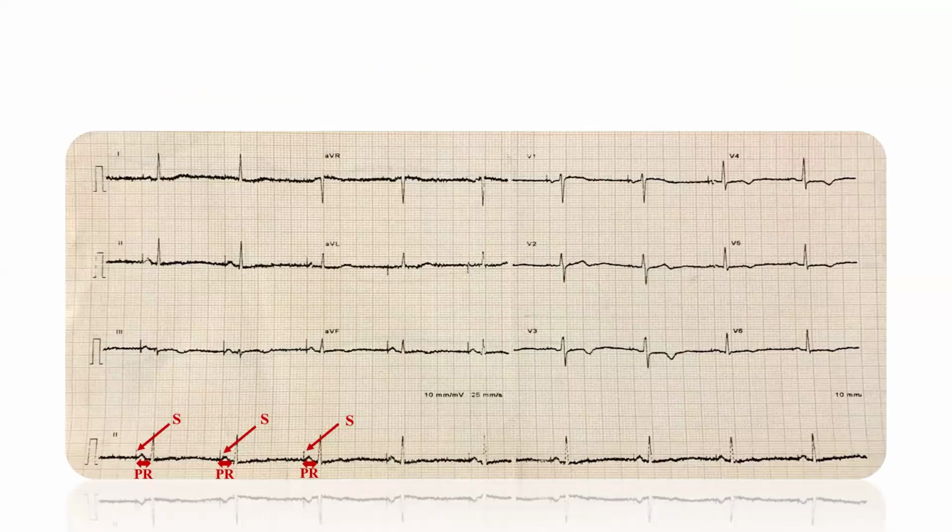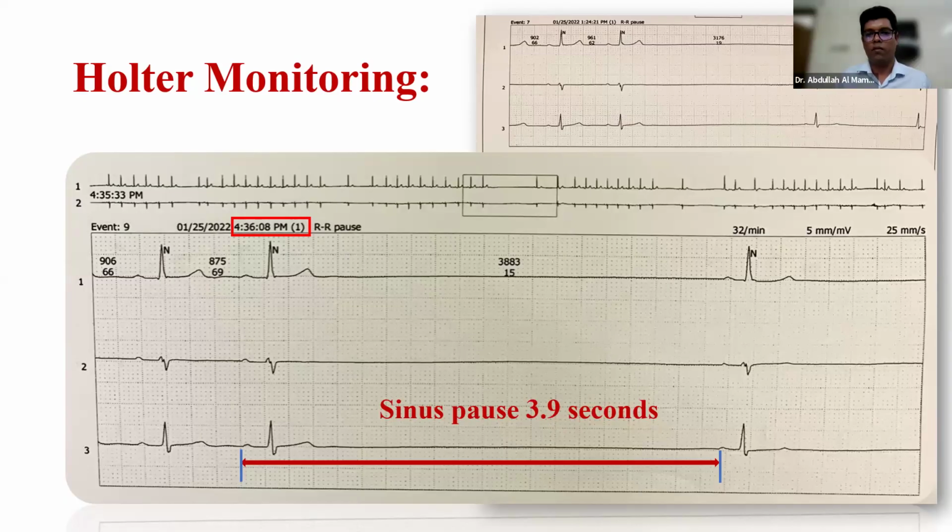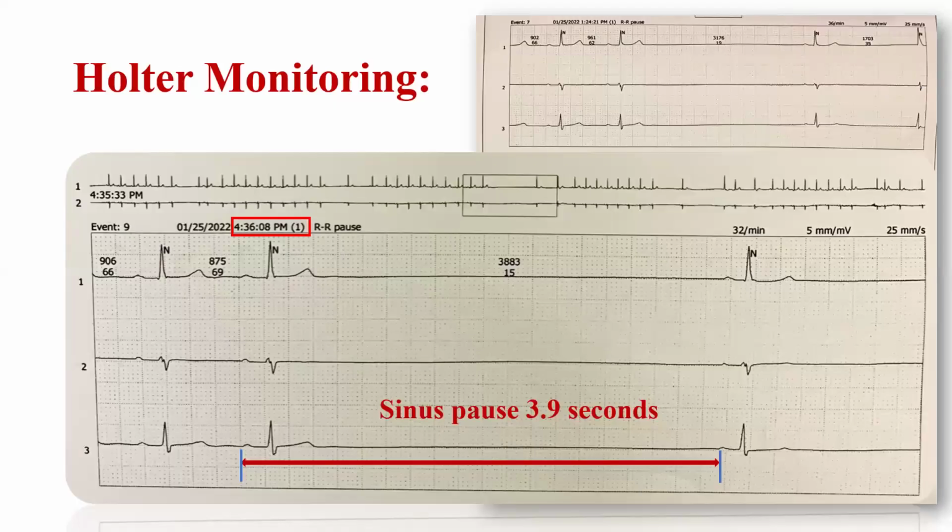One thing to avoid confusion: some authorities reserve the term sick sinus syndrome for a particular condition, that is tachycardia-bradycardia syndrome. Its preferred term is sinus node dysfunction, that encompasses all kinds of sinus node disease, like sinus pause, sinus arrest, sinus node exit block, and for example sinus bradycardia, sinus tachycardia. Everything is covered by sinus node dysfunction.